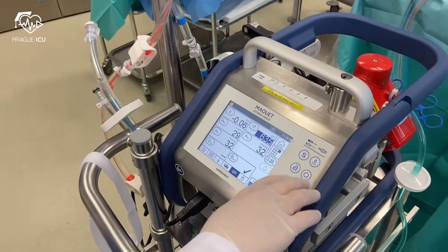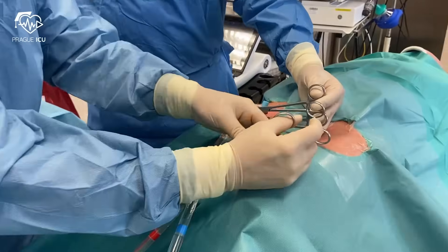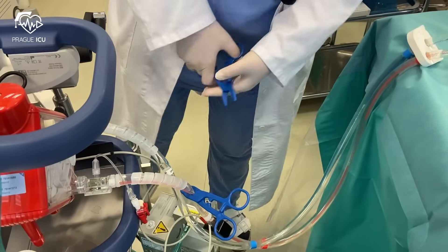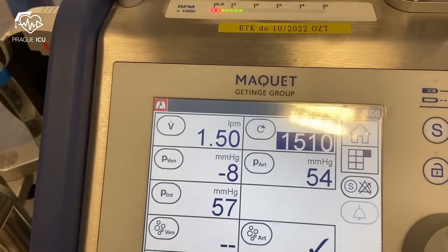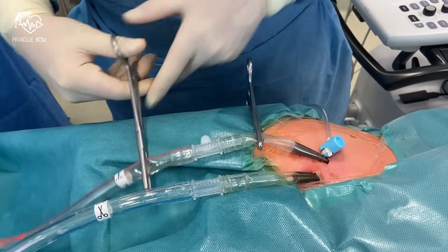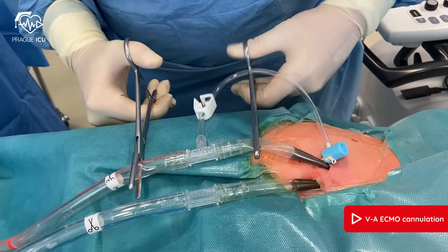Now you can start the ECMO circuit. Set the speed to 1500 revolutions per minute and unclamp all four clamps on the patient side. Then unclamp the venous line and finally slowly unclamp the arterial line on the ECMO side. Now the ECMO flow goes up. To connect the reperfusion cannula, clamp the arterial line before and after the side port, open the clamp on the reperfusion cannula to flush it, attach it to the ECMO arterial line, and then unclamp the line.